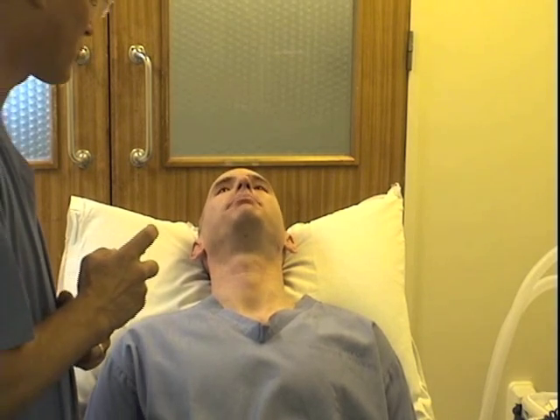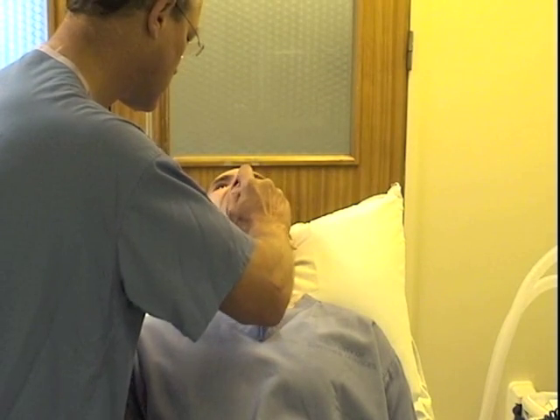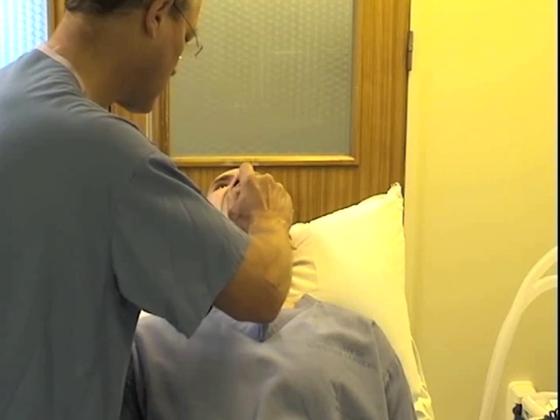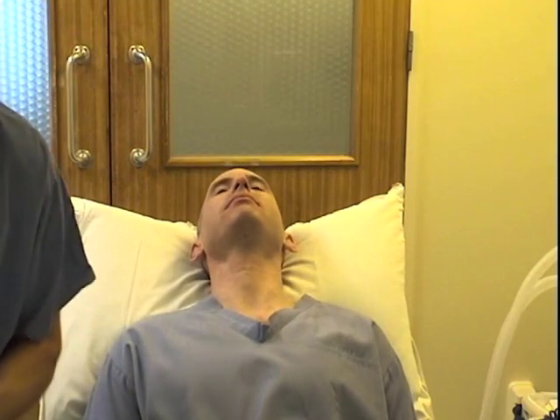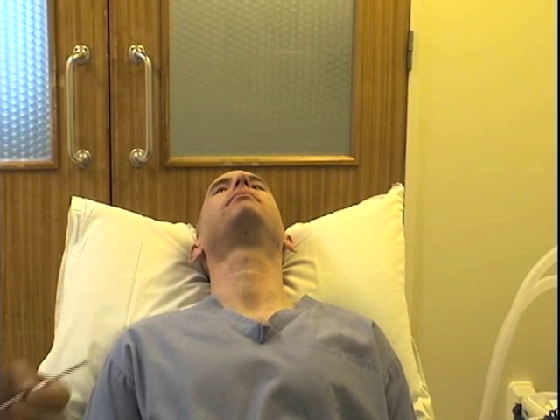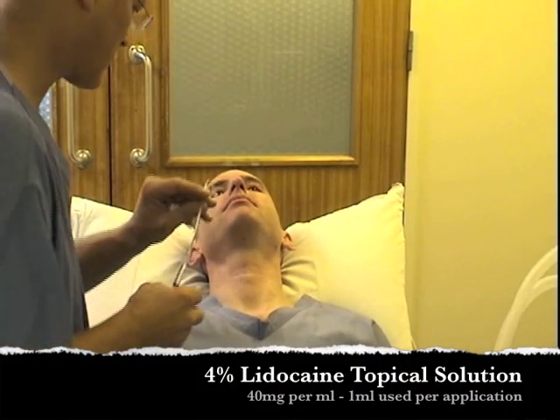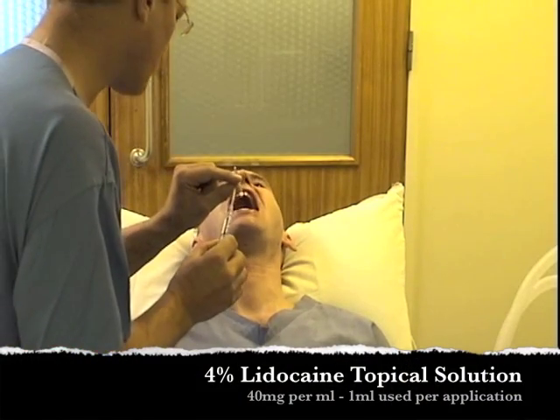I'll have one more go — if you can stick your tongue out as far as you can, I'm going to spray as far around the back of your throat as I can. Using an atomizer device, we're going to try and spray around the back as far onto the larynx as possible. This might make you cough a bit.